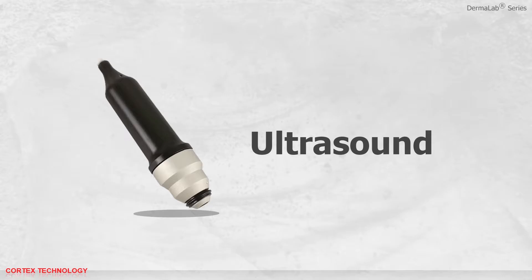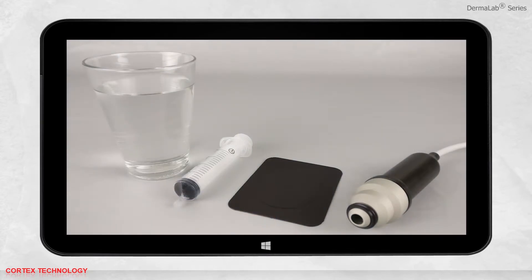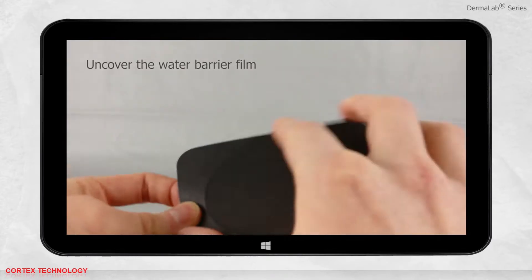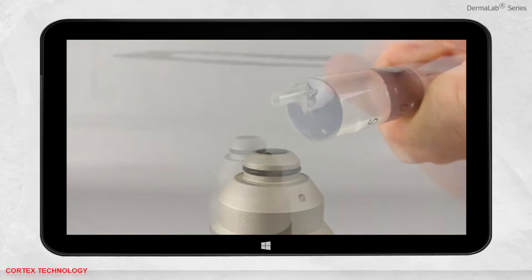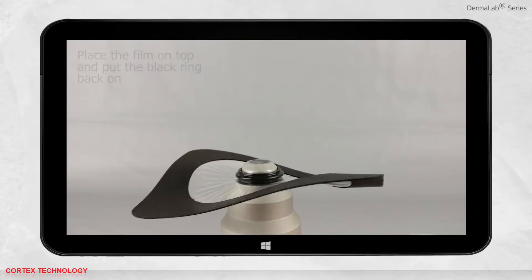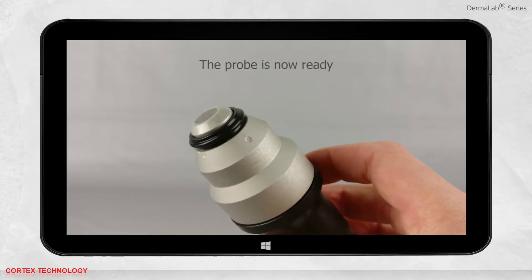Ultrasound application. Select ultrasound. Before you start a measurement, you need to prepare the probe. To do this, you need demineralized water, a syringe, and water barrier film. Remove the black ring from the probe and uncover the film. Fill the syringe with demineralized water, hold the probe upright, and inject the water into the chamber. Place the water barrier film gently on the probe and fixate with the ring. Snap off excess film and check that the film is smooth with no wrinkles. The probe is now ready.